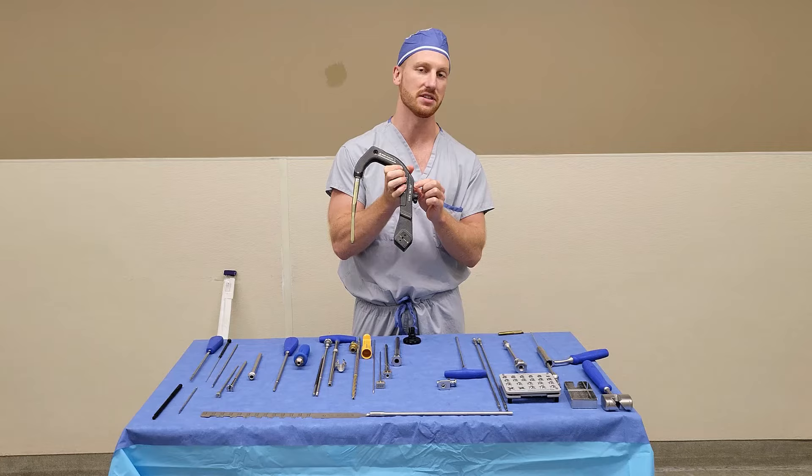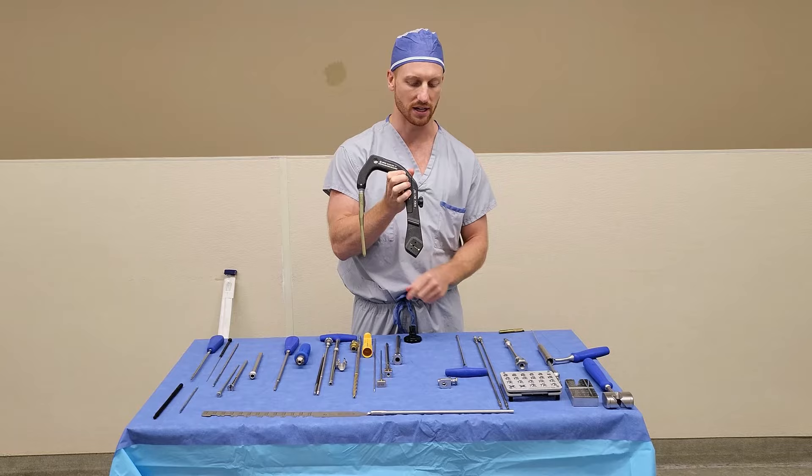Once it is tight, you need to insert the aiming arm and screw that down. It is important to make sure that the aiming arm is the same degrees as the nail you have selected — where it says 130, make sure that 130 nail has been selected.